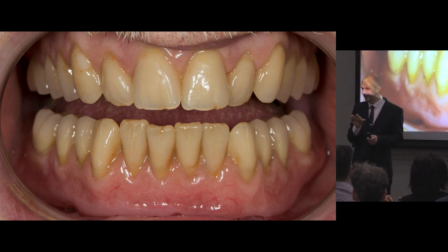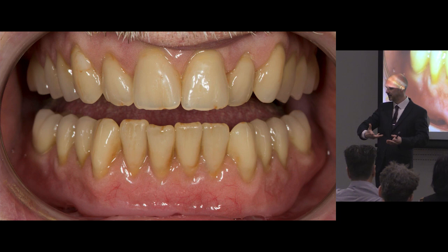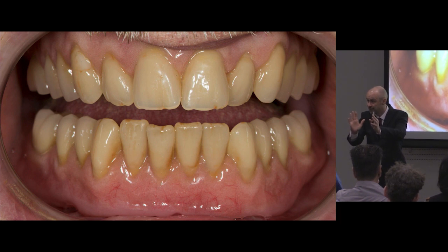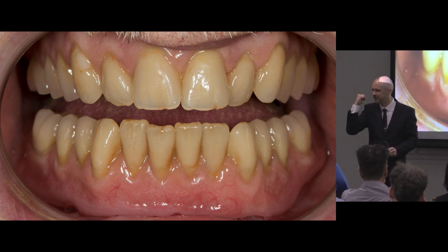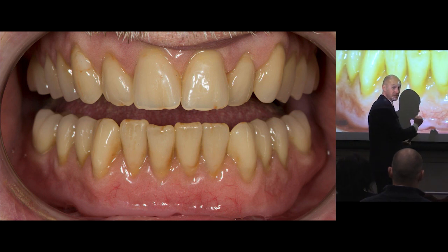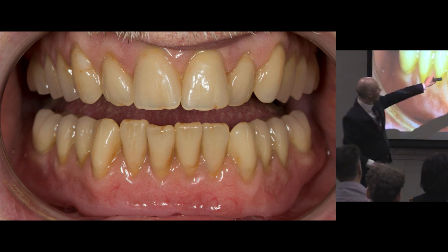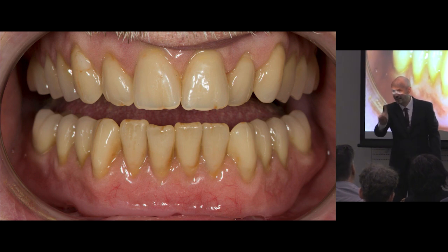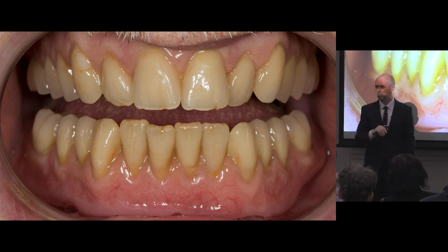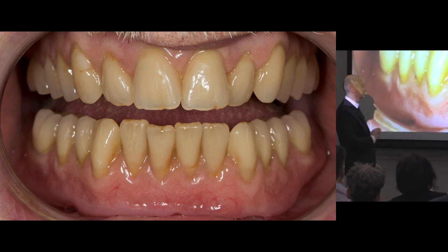And the way that Rowan does this is, the Enigma Life teeth have got a lovely texture to them, as if the teeth erupted as a teenager. And Rowan just sands and smooths off that polished surface, so it's smooth. And then he gets a brand new scalpel blade and cuts it into the tooth, and it actually makes a little tiny groove. And then he gets a little bit of runny composite, and in this case, it's white. Rubs it in, and it looks like a white line. And if we want a brown line, he just puts in brown composite and light cures it, and that's job done. It just adds a level of detail that's really, really good.